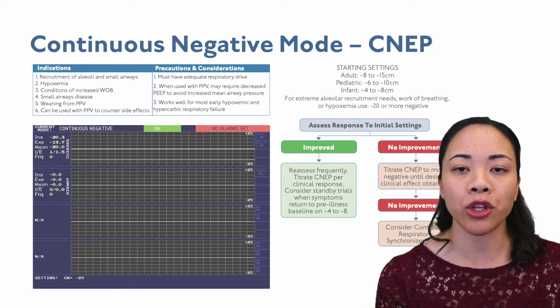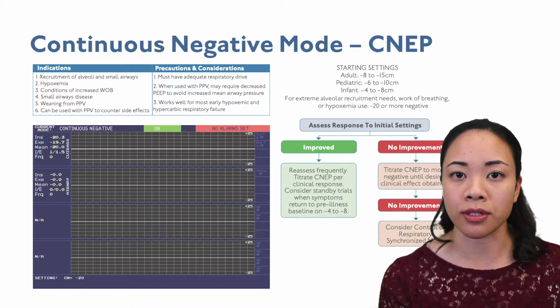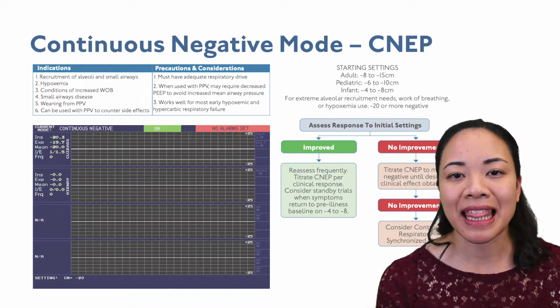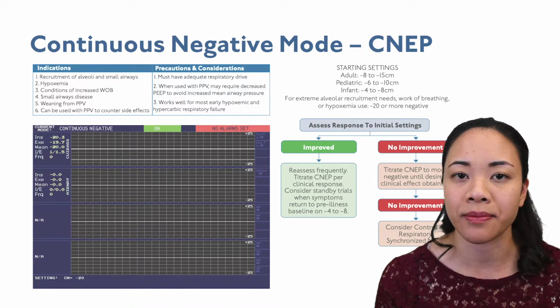Later on, for the other biphasic modalities, you will see that those values will vary depending on the inspiratory and expiratory pressure set, especially the mean Cuirass pressure, or mean. This is important, as this value would be relevant to the end expiratory volume left in our lungs.